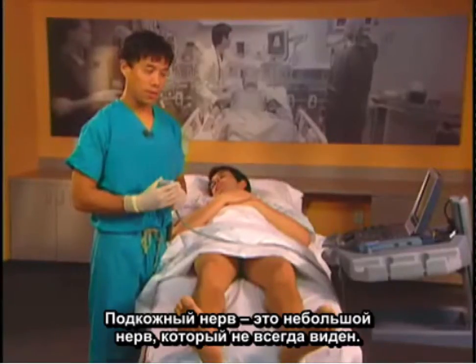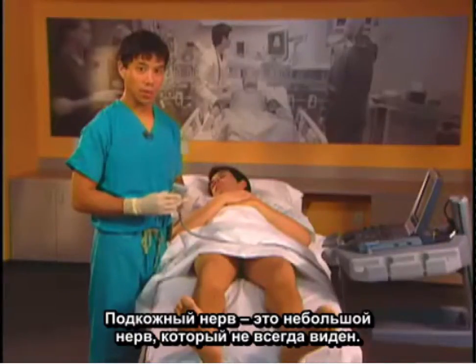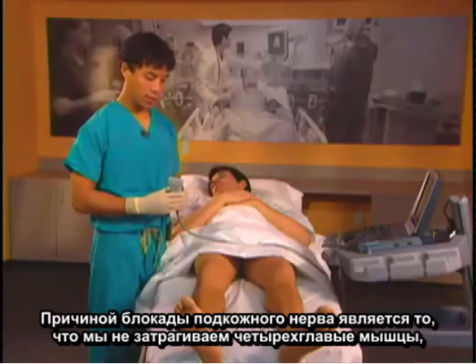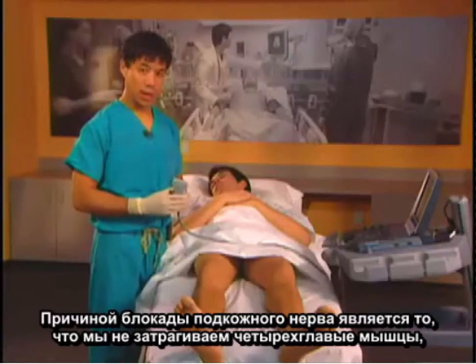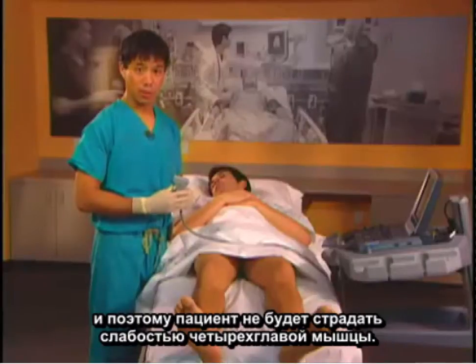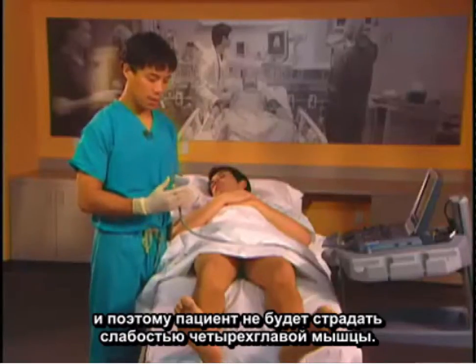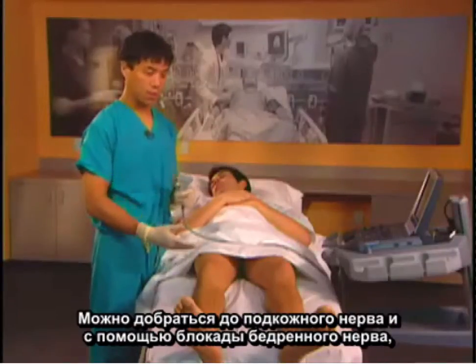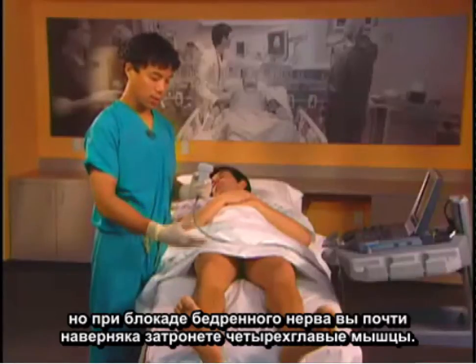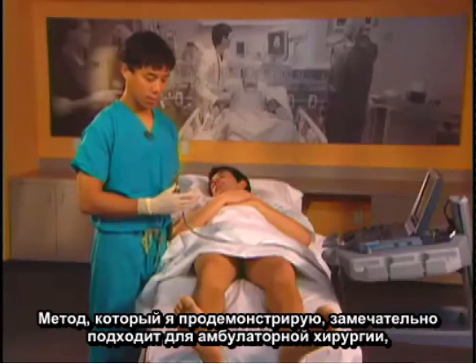The saphenous nerve is a small nerve and we may not see it in everybody — in fact, most people we don't see it in. The reason we do a saphenous nerve block rather than a femoral block is that we don't take away any quadriceps muscle strength. By doing a femoral block, you will take out all your quadriceps.